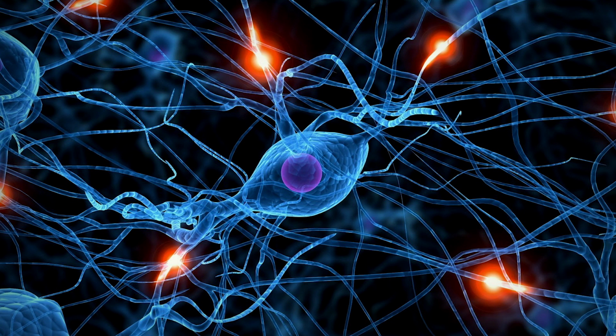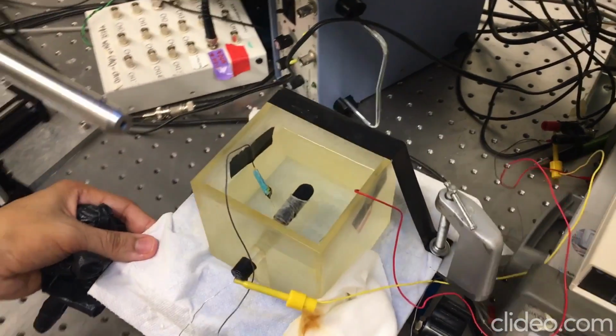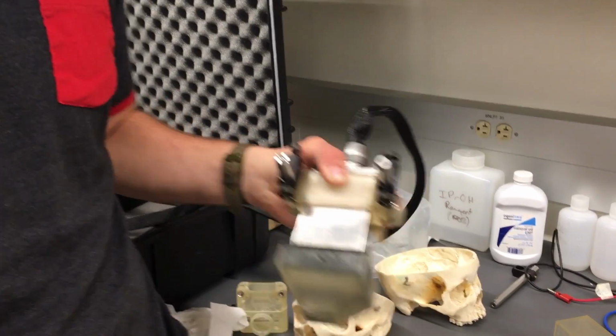One of the parameters that directly affects the sensitivity of our signal is the pathway of neuron activity. Therefore, I am optimizing our test chamber to best emulate this pathway. In addition, I manufacture adapters for ultrasound transducers to aid in our design's medical application.